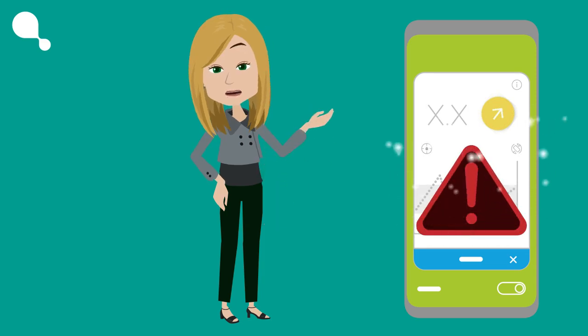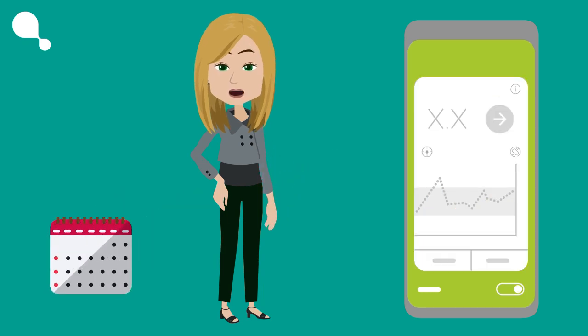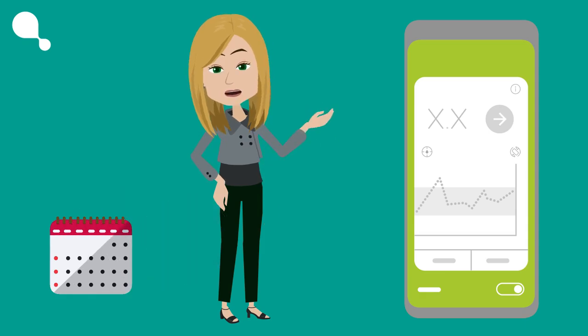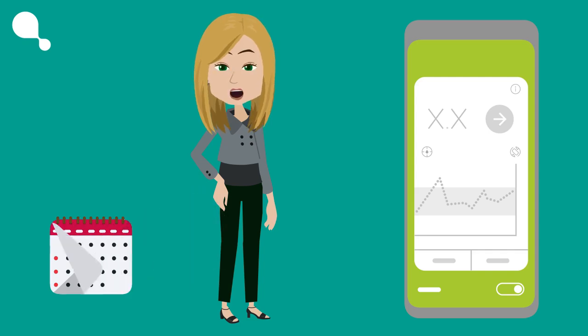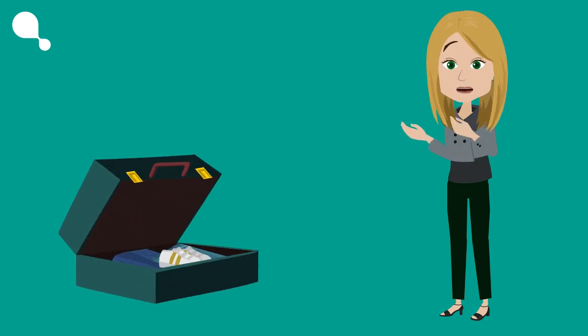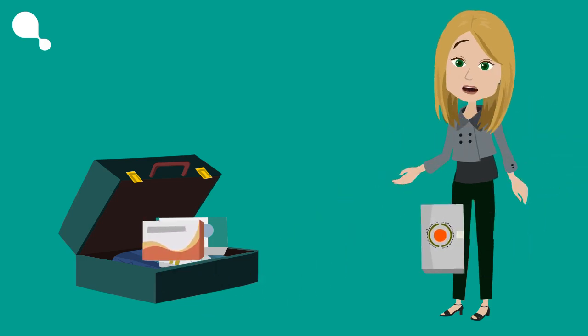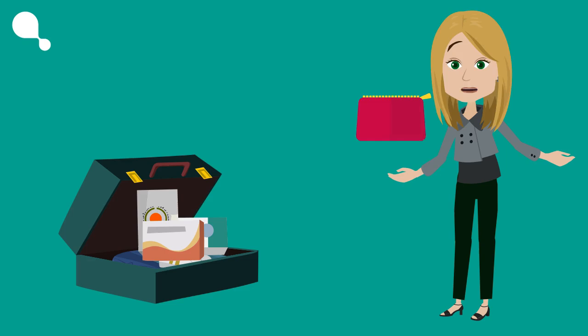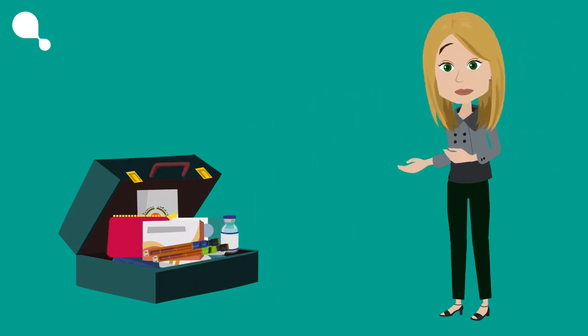Please immediately change your infusion tubing, cannula, and reservoir if you are running high and Boost is not bringing glucose levels down. As the pregnancy progresses, you may need to change your infusion set and reservoir more regularly, possibly every 1 to 2 days, to ensure that you are absorbing the insulin properly. When away from home, please don't forget to pack your bag with plenty of spare infusion sets, reservoirs, sensors, blood glucose, and ketone testing equipment as well as insulin pens and vials.